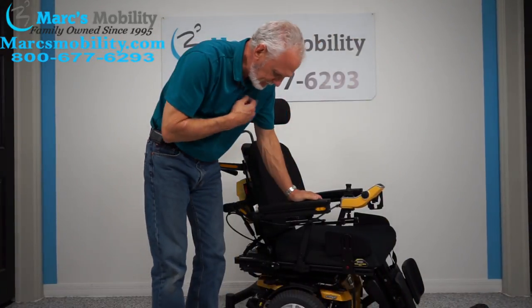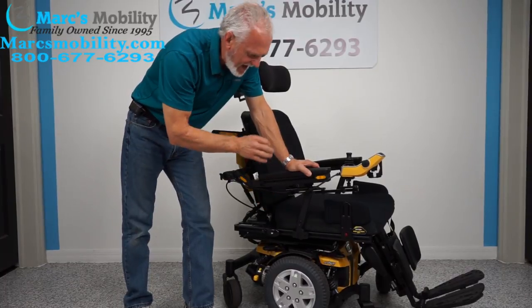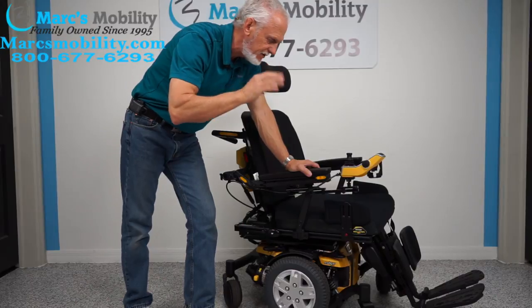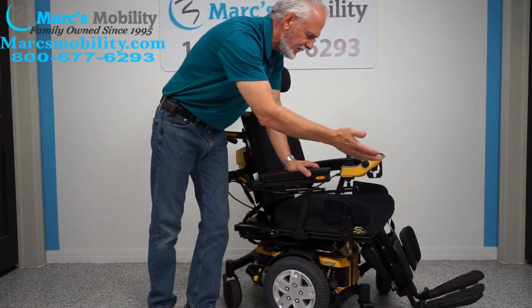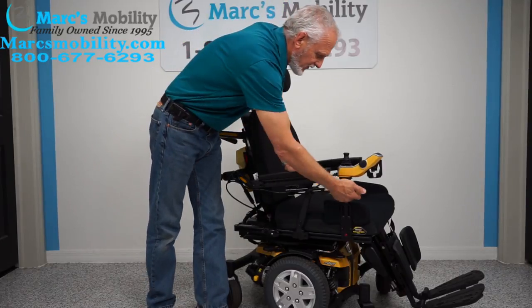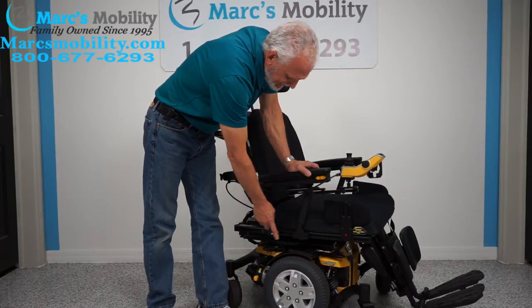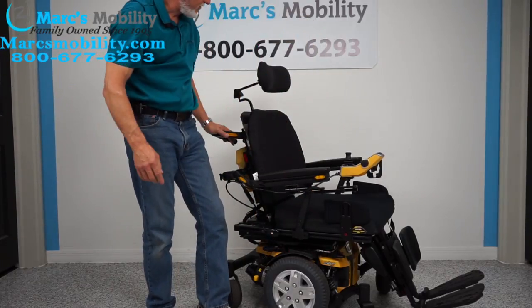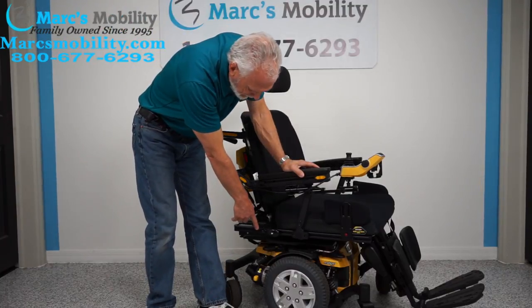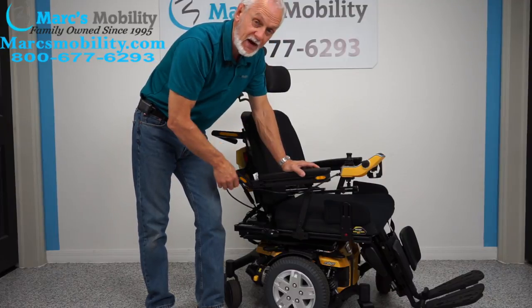Let's recap what we have here. We have a Pride Mobility Quantum Edge HD Eye Level with the 10 inch seat lift, electric tilt, electric recline, and electric feet. This chair has 23 miles and was used for a couple months. It has the swing-away joystick, reinforced arms, lateral knee pads, light kit, push bars, adjustable headrest, and HD motors. If you need a heavy duty power chair, this is a pretty nice one to look at.